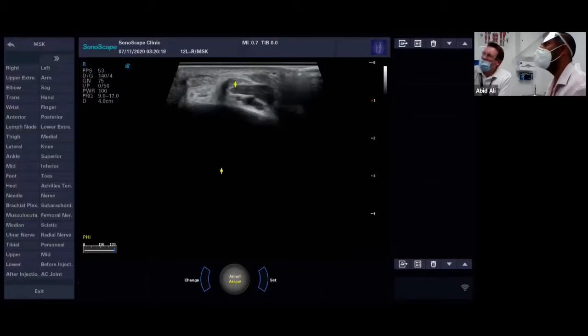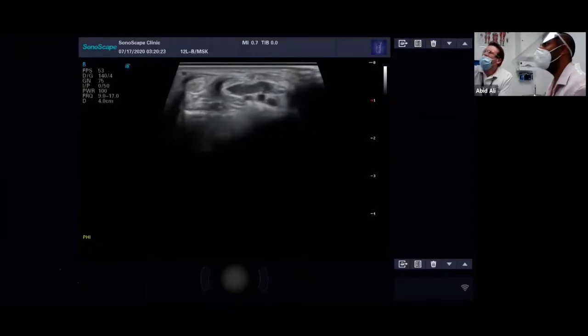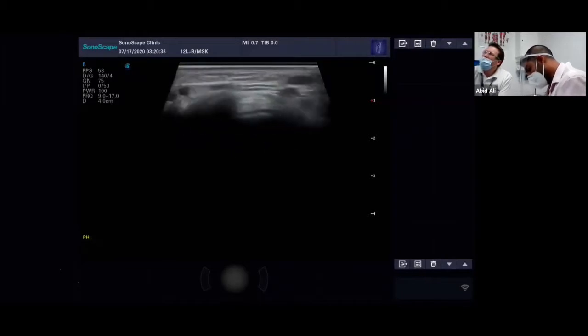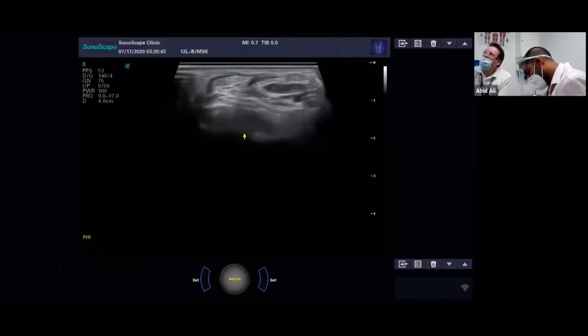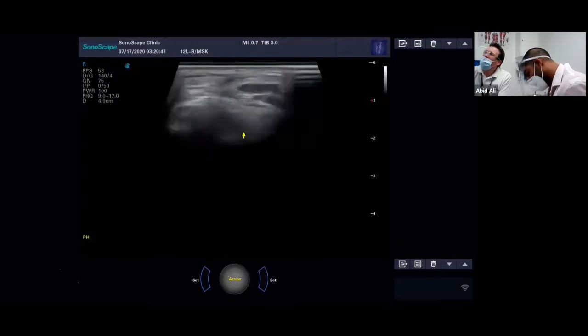I lost a little bit of image there, so let's just get a better picture. Of course, we're losing some image on the lateral side, because our probe is straight and the ankle is curved, so we've got a fall off at the end here. So we're going to have to do this ankle exam in two components. We'll start medially, go anteriorly, and then to make out the more anterolateral structures, we're going to have to move our probe position.